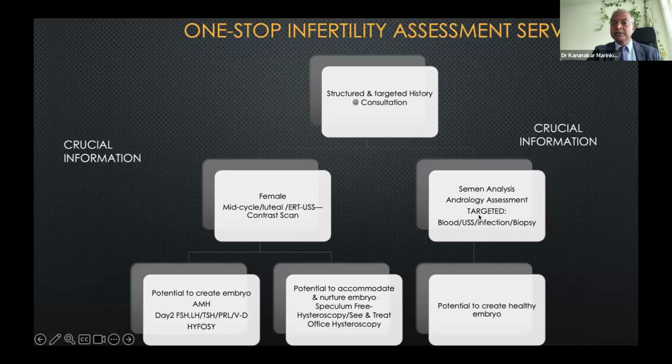You can do a complete assessment of the male in terms of the structural, endocrine, and ultrasound assessment of the testis, as well as the psychosexual dysfunction. This eventually, in the single one-stop fertility or infertility assessment approach, will give you 3 outcomes.